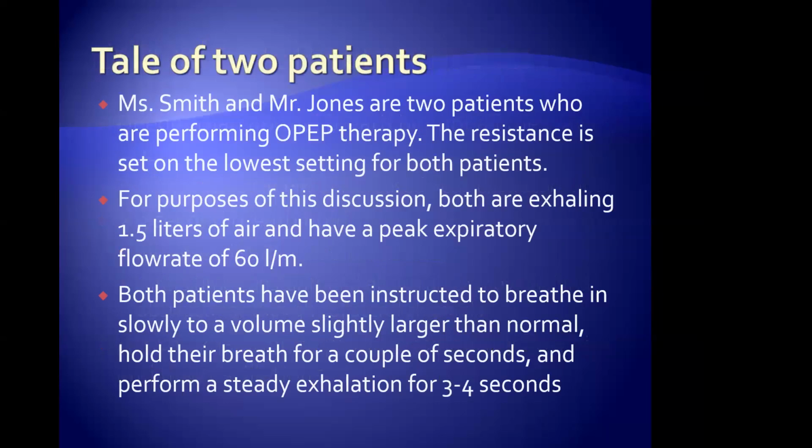All right, here's the tale of two patients. And we probably do this all the time. So Ms. Smith and Mr. Jones, two patients who are performing OPEP therapy. The resistance is set on the lowest setting because we're teaching our patients, we're coaching them up. I want them to do this. For the purposes of what we're talking about this morning, both are exhaling at 1.5 liters of air and have a peak flow of 60.